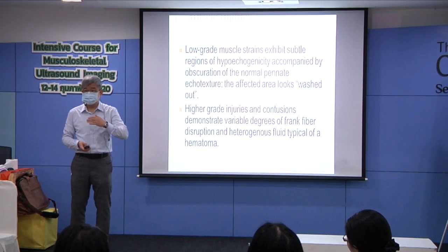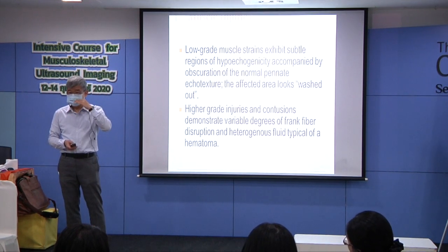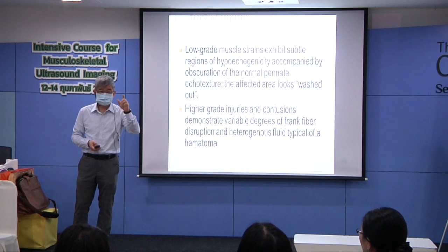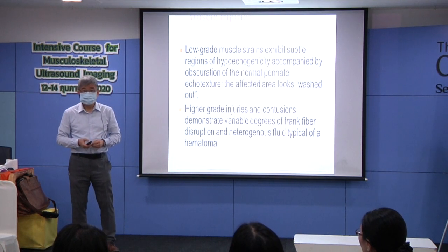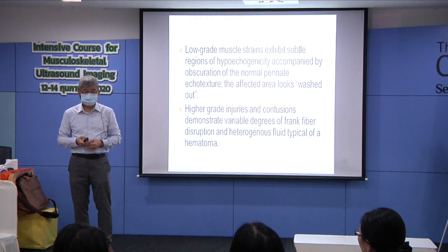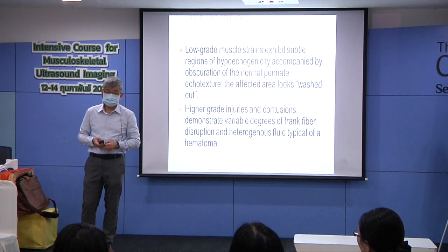Okay, so in order to have this imaging, you need to know how to use the scale properly. 7 scale, right? 7 scale. So ultrasound needs a lot of practice. The biggest problem before is ultrasound is very expensive. No one can buy it like a toy and bring ultrasound with you every day and use it every day.